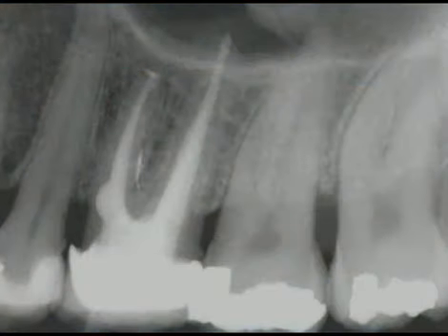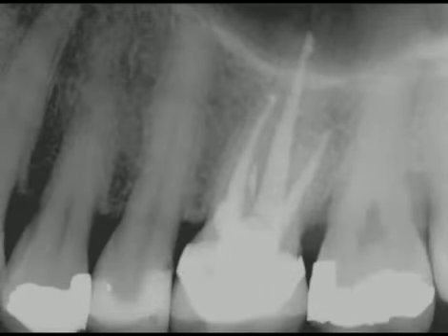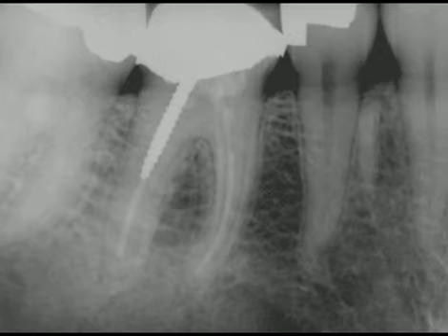An off-angled radiograph reveals a well-packed resorptive defect, a furcal canal, and the PFM crown provisionalized. It's good to see on a 4-year recall that a new restorative and endodontic healing has occurred. This radiograph of a mandibular right first molar demonstrates a PFM crown, a screw post, and inadequate endodontic treatment.